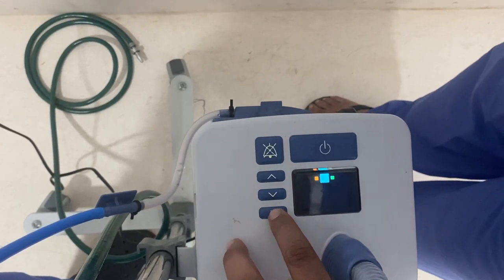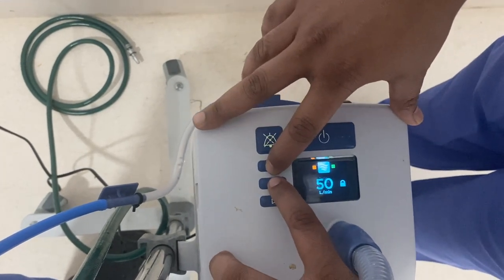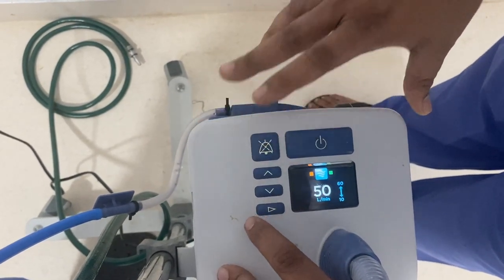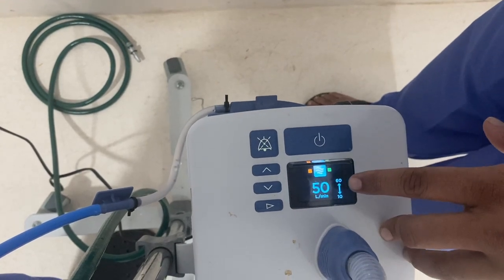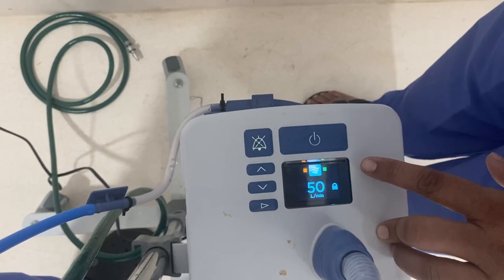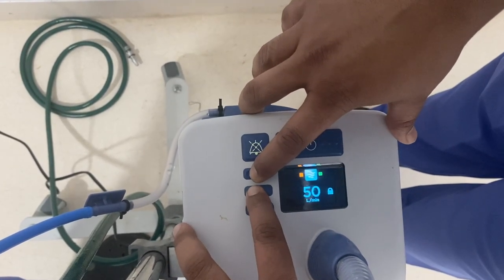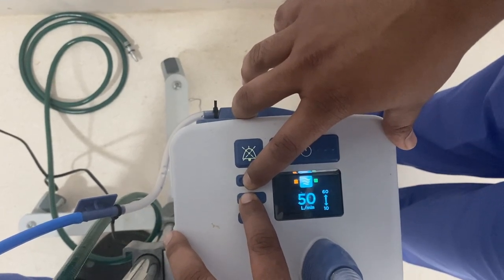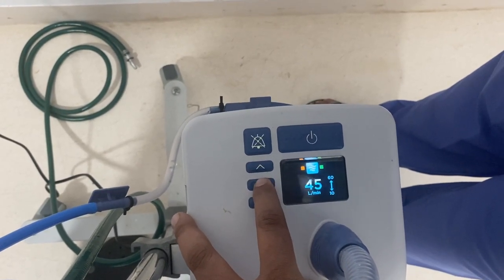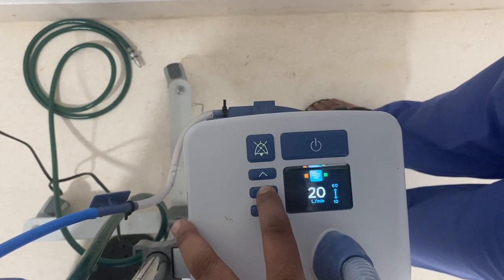If you press the mode button again, we come to the flow setting. Again, we can change the flow by long pressing the up and down buttons for 3 seconds until the flow value starts blinking. The limits are 10 liters per minute to 60 liters per minute. We can set it as necessary — 60, 55, 50, 45, 40. After 30, the unit reduces in increments of 1.